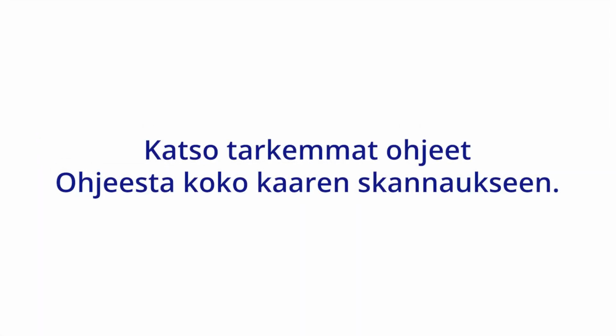For more detailed instructions, see our guide for full arch scanning.